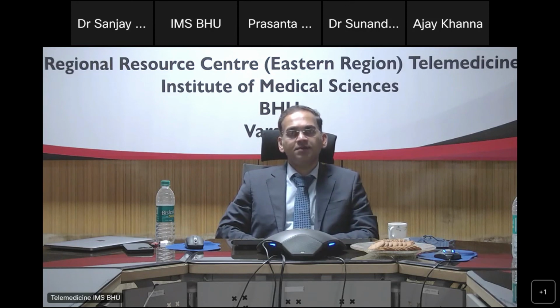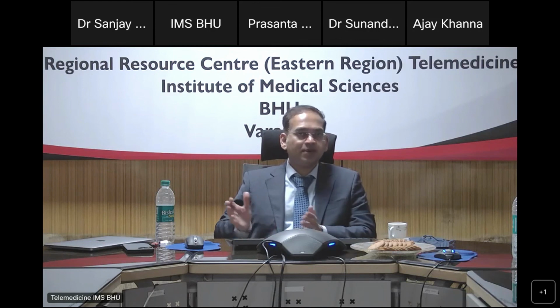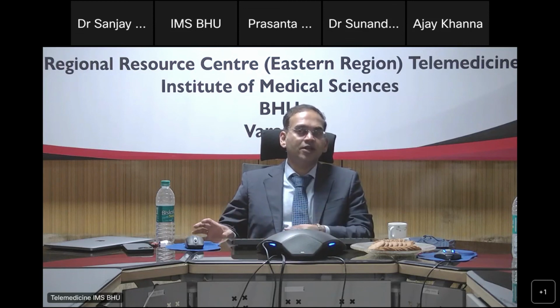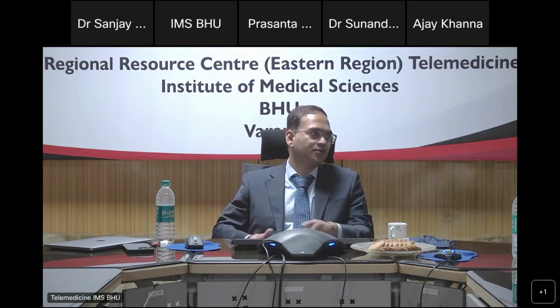Yeah, so all our patients who come through rheumatology with clinical suspicion of aortoarteritis do undergo FDG PET. The FDG PET is combined with the CT, so there is a PET portion, there is an attenuation correction CT portion, and there is a CTA that is done at the same time. We read in collaboration with the nuclear medicine people. They will issue the PET report and we will issue the CT report.